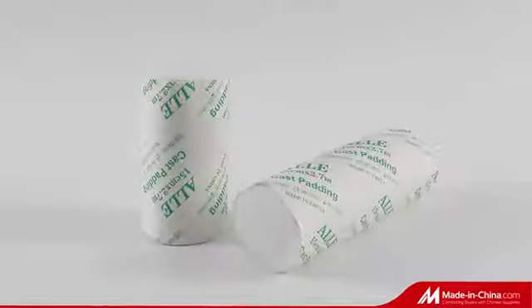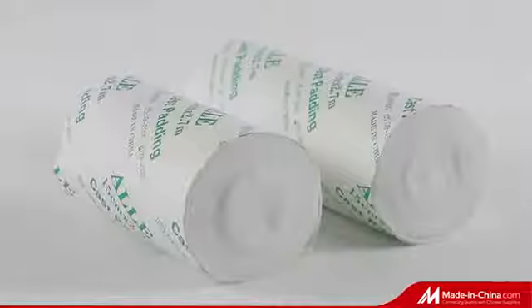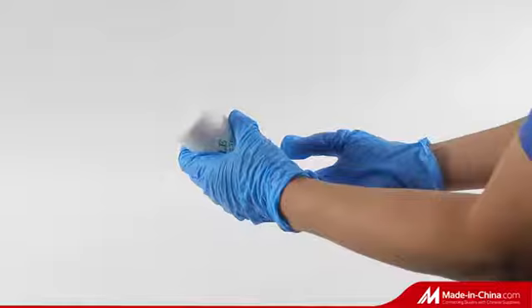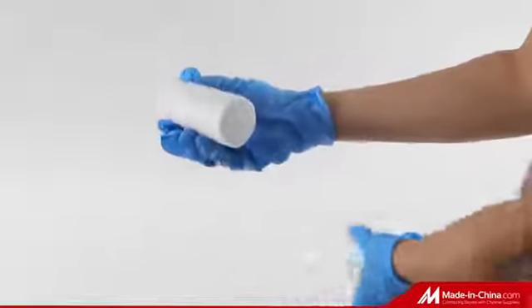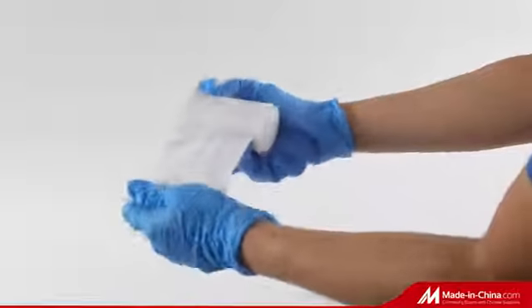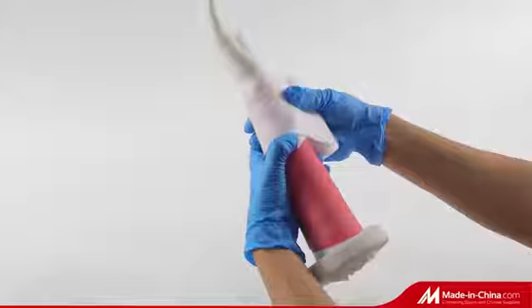Cast padding is a synthetic, protective orthopedic bandage. It uses medical non-woven cloth, cotton, or polyester as its raw material. It is widely used as a cushioning material with plaster of Paris bandage or fiberglass bandage to protect skin and eliminate heat.